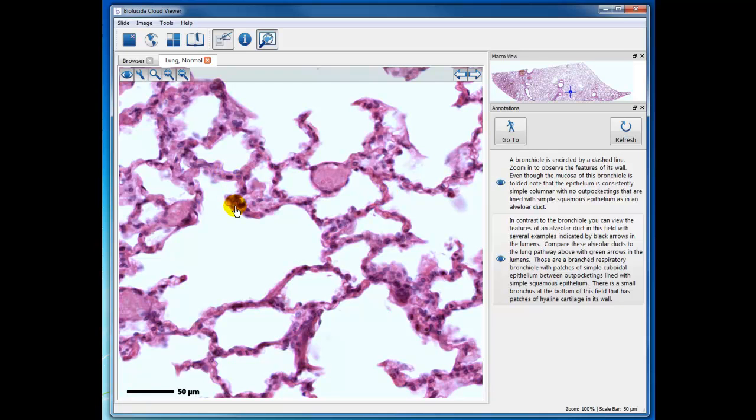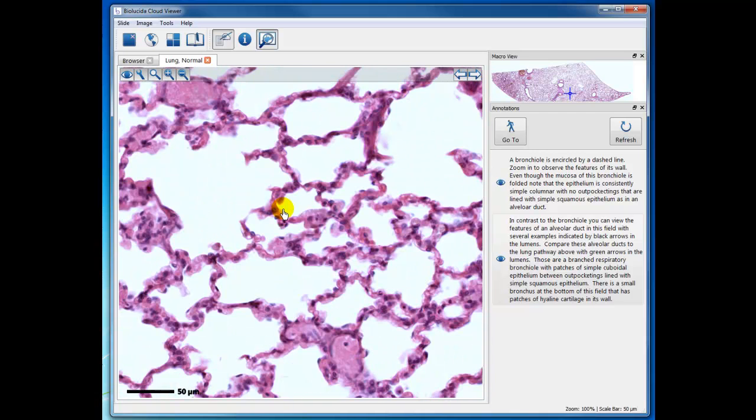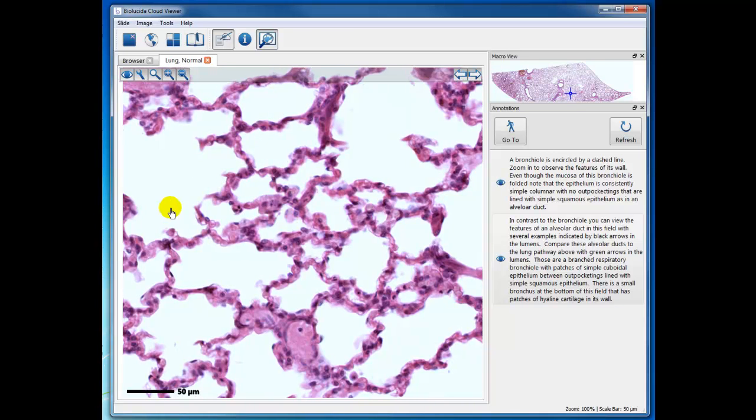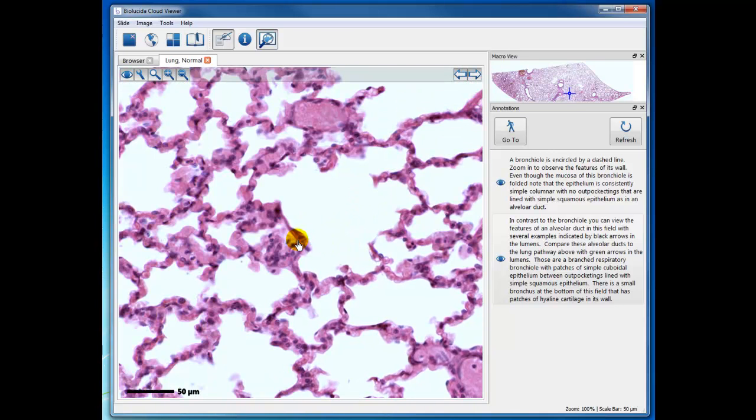And so looking at the individual alveoli here, you can just barely see the nuclei of the lining, and for example, here is a fairly large cell, and I can artificially enlarge that just a little bit, and that would be an example of a type 2 pulmonary cell, or a type 2 pneumocyte that secretes surfactant, and another one over here. If you find any cells within the alveoli, those will be macrophages crawling along.